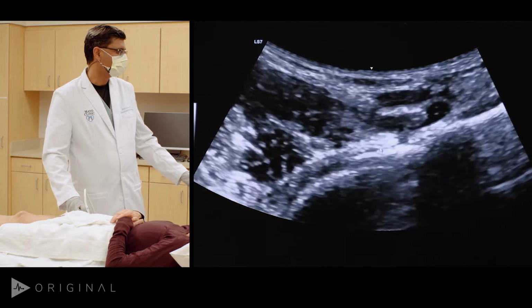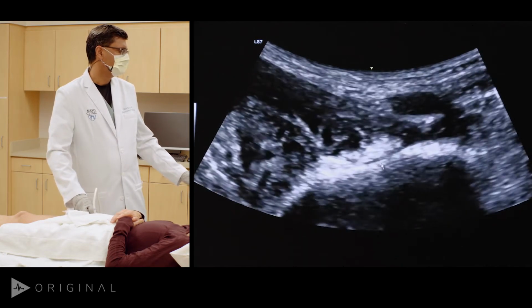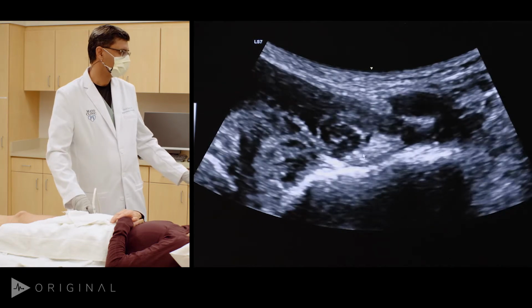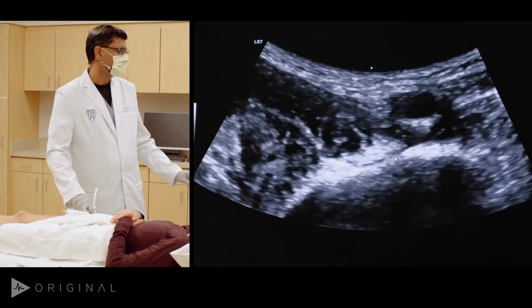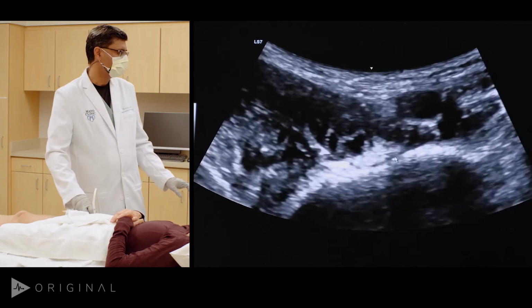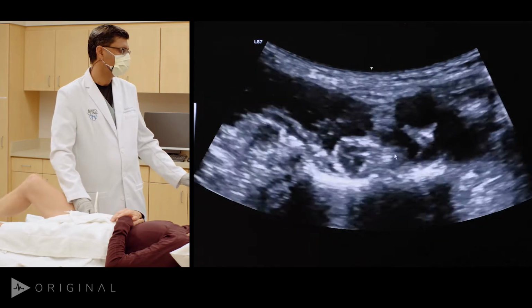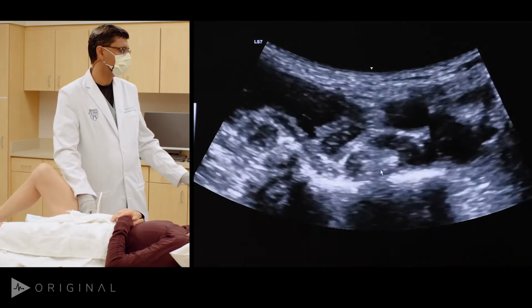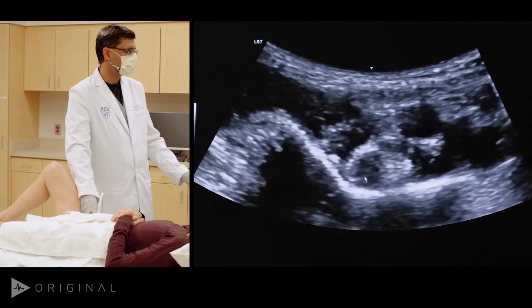As you can see on the screen, this hyperechoic structure, that's the acetabulum. This hyperechoic structure is the iliopsoas tendon. So now slowly we'll ask our model to bring the leg up. We stay on that tendon. You can see the tendon is still there. The muscle is trying to go around it. Externally rotate.